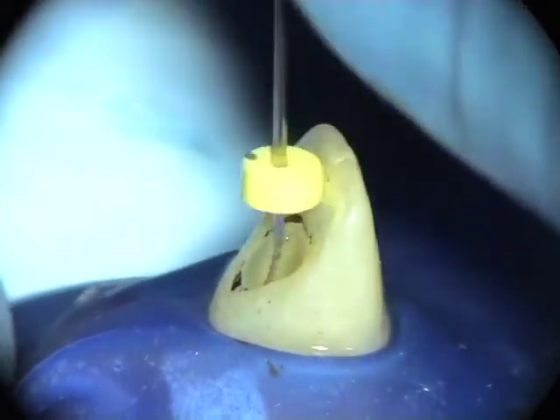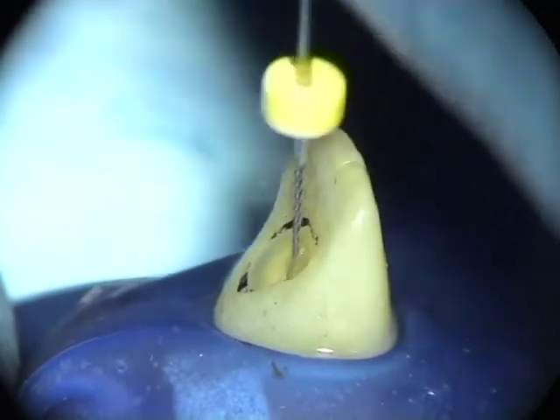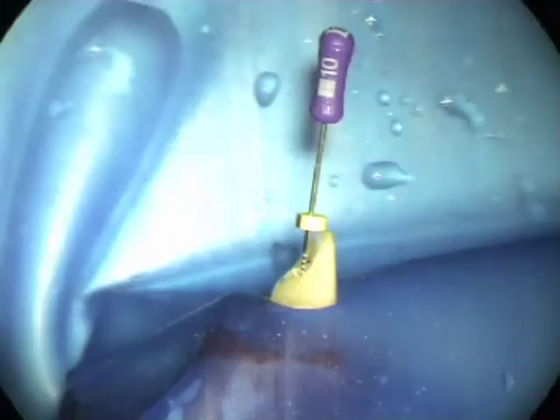Once access cavity is completed, a fine file placed in the canal should stand along the long axis of the tooth without binding on dentine of the pulp chamber wall.